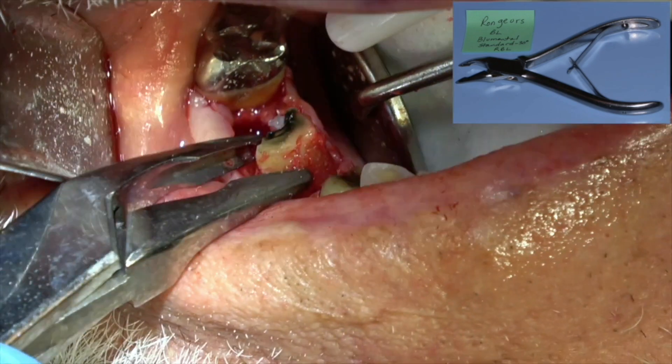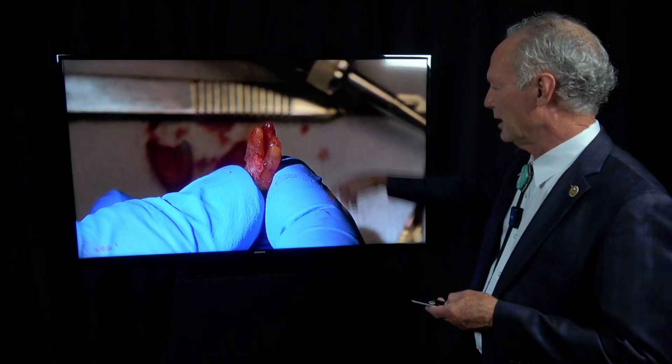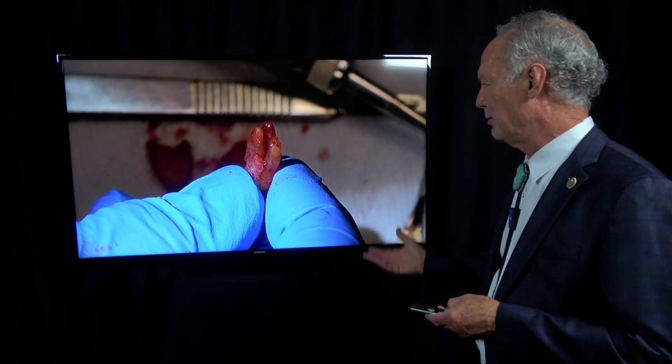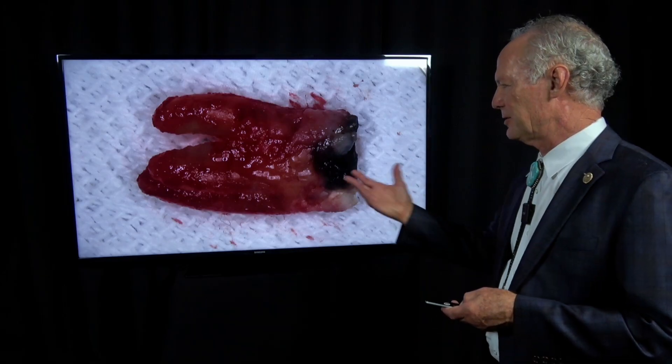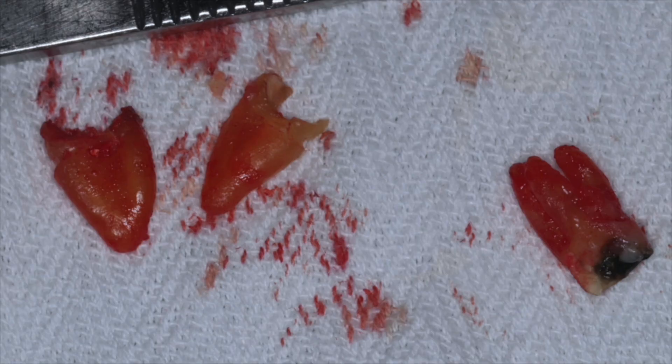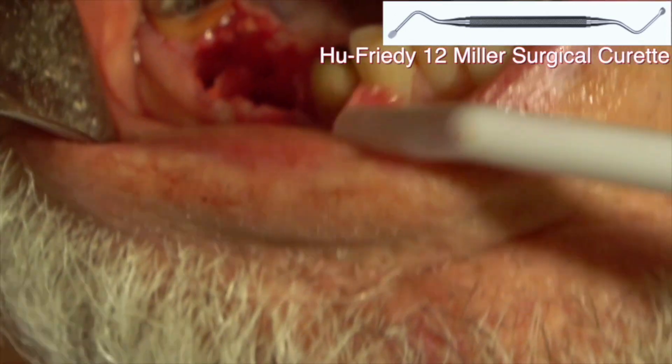Finally, here we go. This was an interesting bicuspid because you can see it's got three roots. How many times have you seen that? I can't remember ever seeing that before this one. Our editor studied this and said there's less than 1% chance — so this is an anomaly. You can see all the decay. Teeth are out.